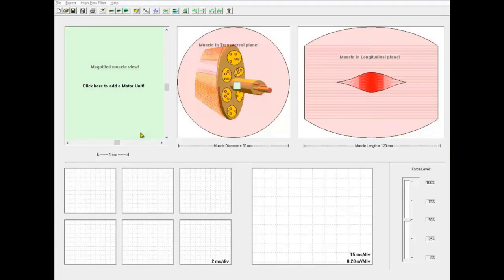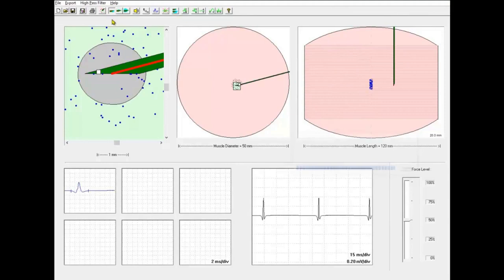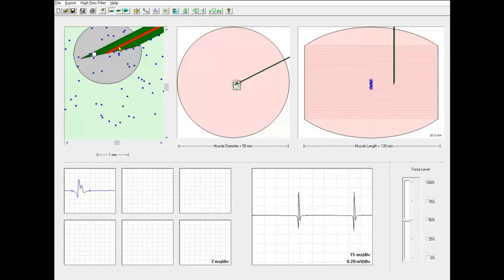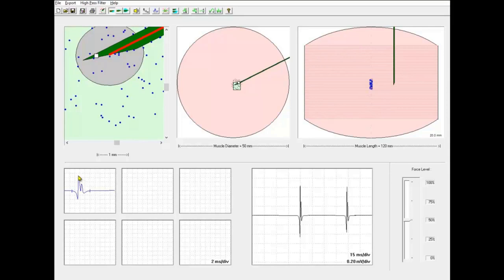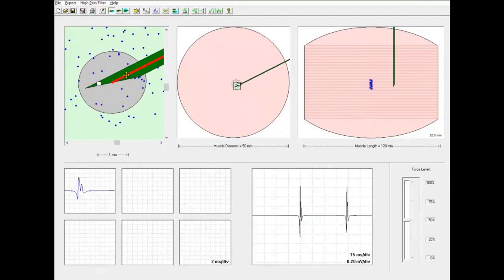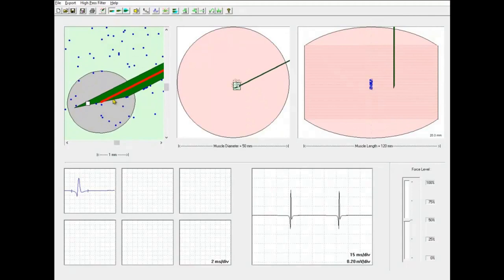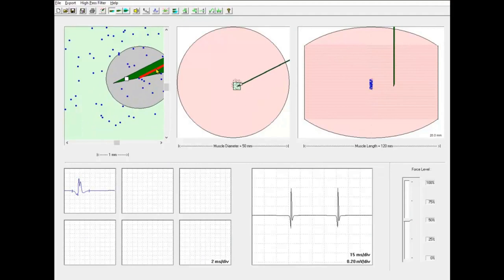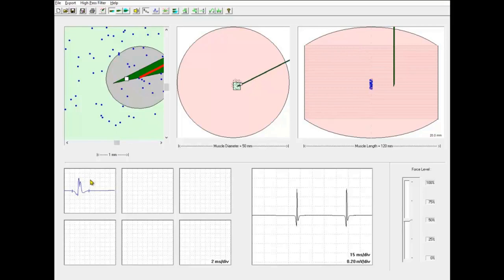This is an EMG simulator based on data from literature. This is the cross section of the muscle, longitudinal section with motor end plates here in the center. We insert the muscle fibers and also insert the concentric needle electrode that I can move in the same way as in routine. This particular position gave rise to this motor unit potential. If we move the electrode to another place in the muscle, we get other shapes of the motor unit potential — showing how in the same motor unit we can get any shape. But for a standard position, the motor unit potential has a constant shape.